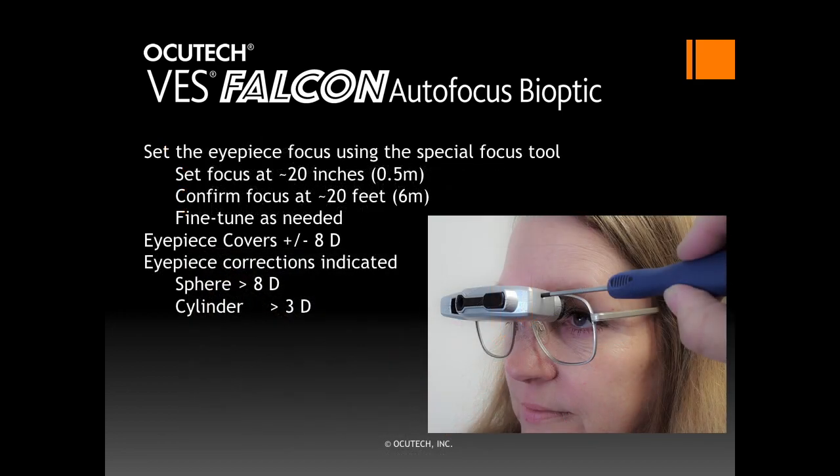When first starting, the Falcon will run a brief self-check. Once complete, ask the patient to look through the Falcon eyepiece at a visual acuity chart positioned at about 20 inches away. Insert the eyepiece focus tool and rotate it to move the eyepiece in or out until the patient reports that the focus is sharp. Turning the eyepiece inward will correct for myopia; turning it outward will correct for hyperopia. Once properly focused, ask the patient to look at another visual acuity chart about 20 feet away to confirm that the focus remains correct. Refine the focus if necessary.